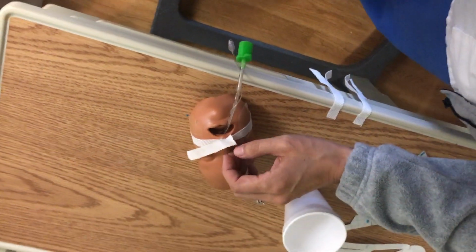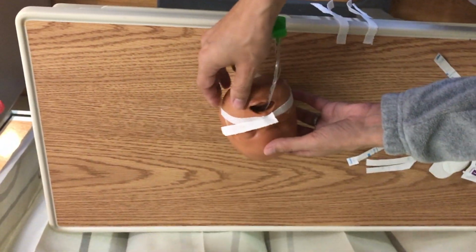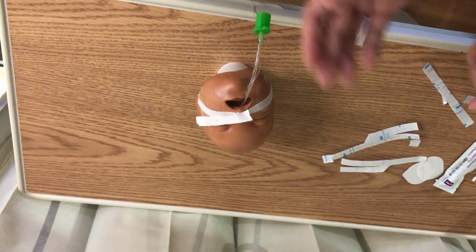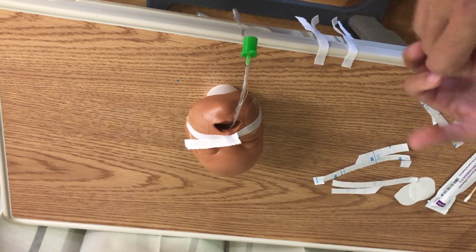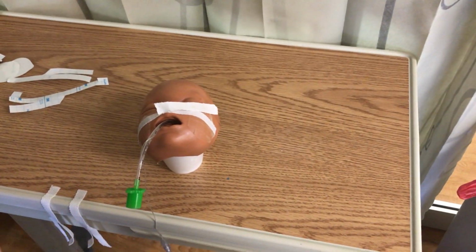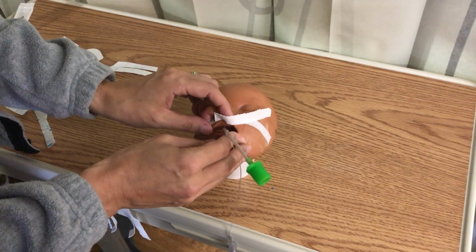Alright, so now I'm going to show you guys some common mistakes in taping ET tubes and how they can lead to a decrease in tube security. And this will kind of show you why it's so important to make sure that every time we tape a tube, we're doing it the same way. Alright, so I'm going to go ahead and use my same tape from before.